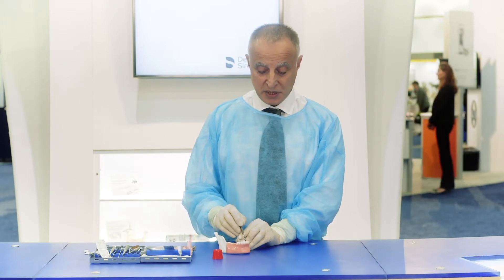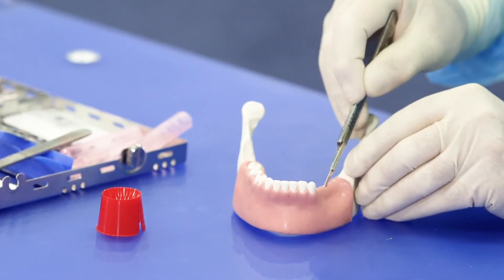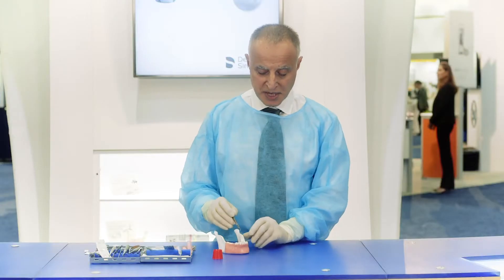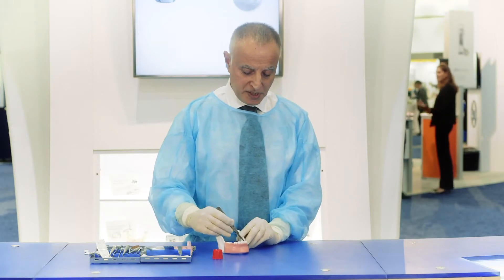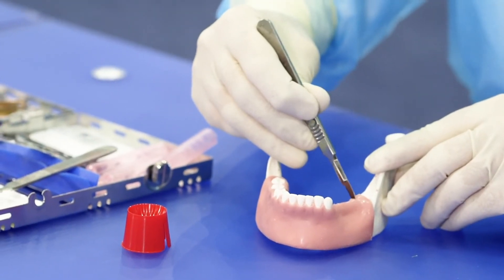The first thing that we do is a mid-crestal incision. In most cases we are going to need some vertical incision, release incisions on the mesial and the distal aspect.